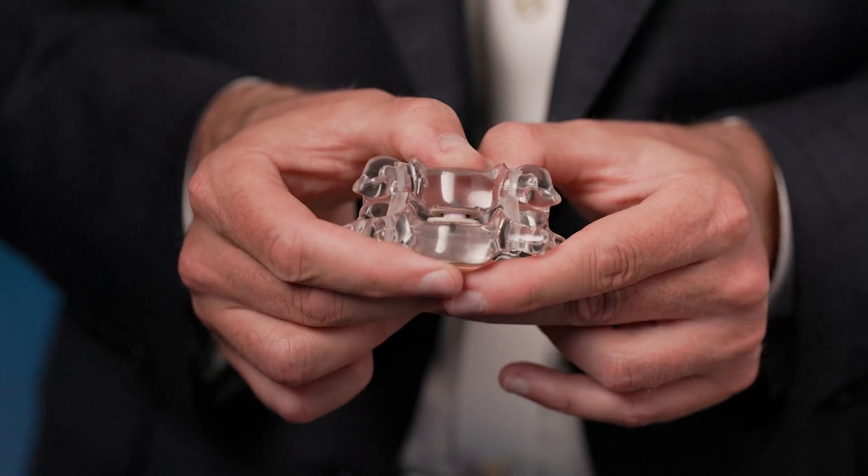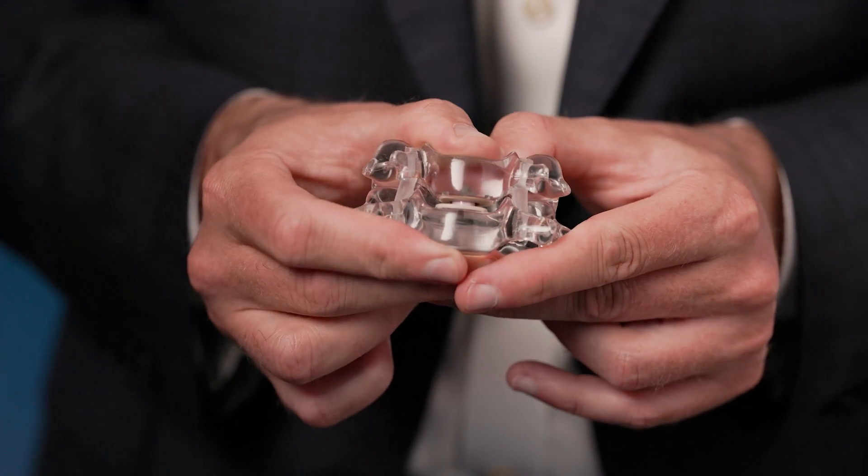This involves putting in a moving implant that mimics the natural movement of the spine. It's a motion-preservation surgery.